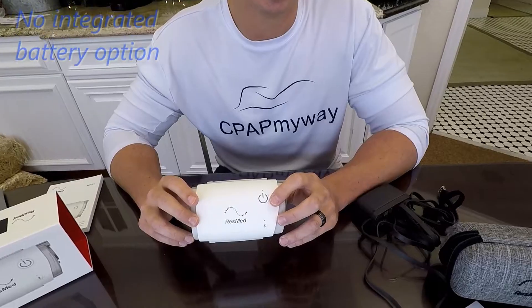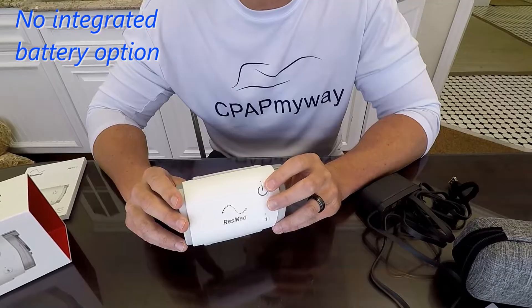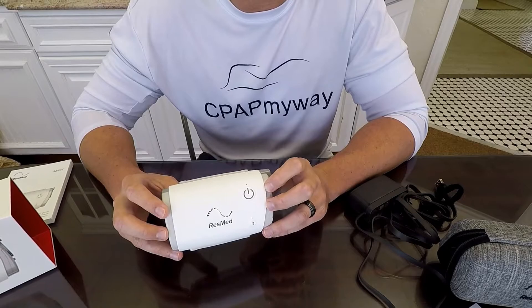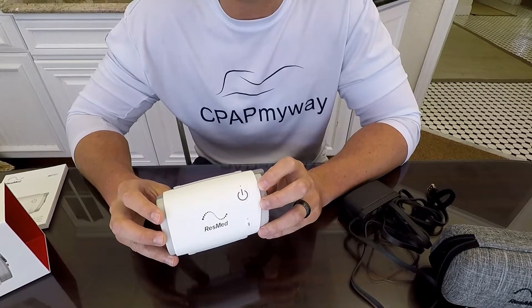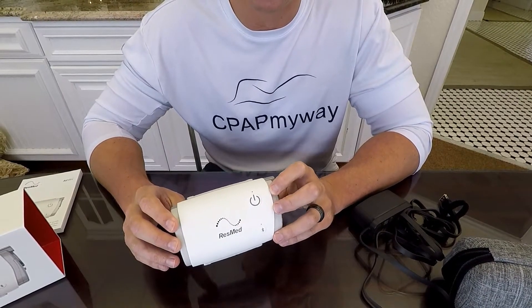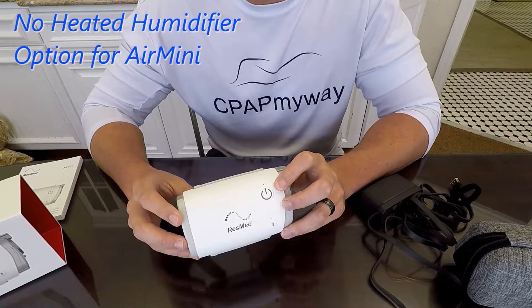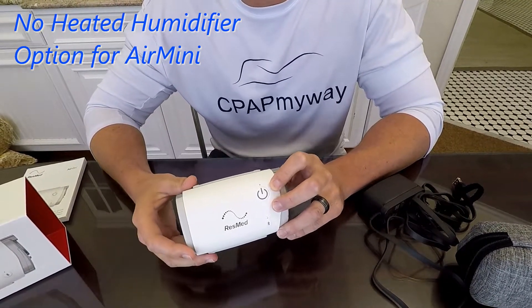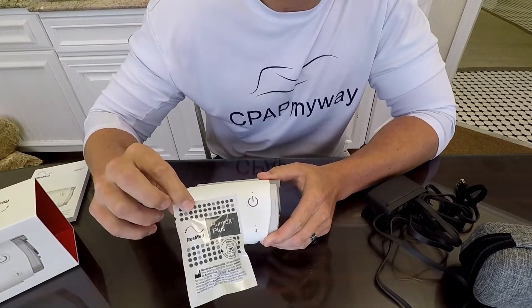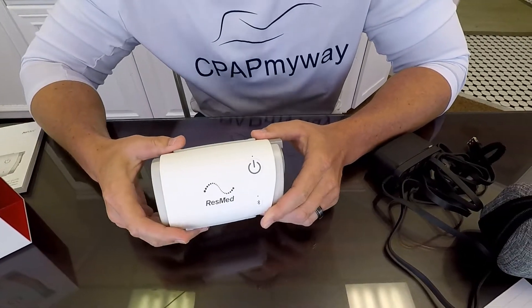Another con is that it doesn't have a designated battery. Pretty much all other travel CPAPs have a battery designed for their specific unit — this does not. However, it works with a couple of off-brand batteries really well. Specifically, the Freedom battery does a great job on it, and we've seen a single battery last three nights. The other thing is there's no heated humidifier option. You have to use the brand-specific HME — heat moisture exchanger — called the Humidex. We'll show you more about those later.